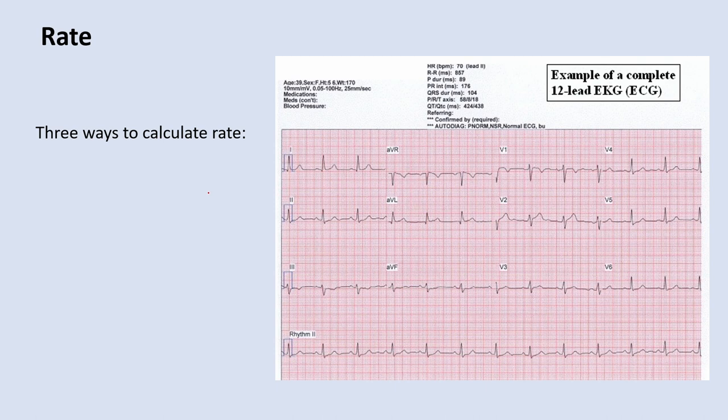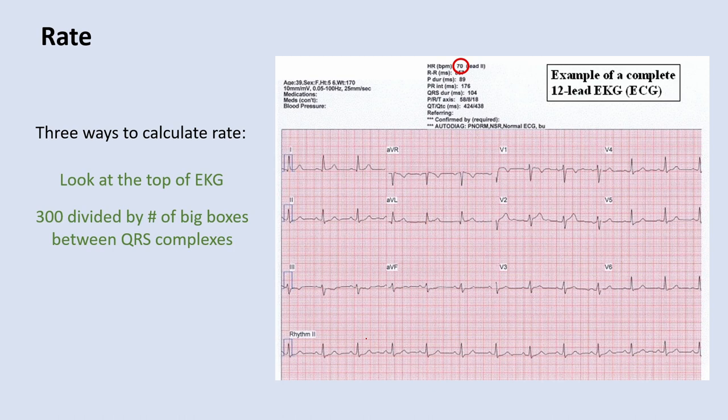The first thing we're going to look at is the rate. There are three ways to calculate the rate. The first is kind of sarcastic — just look at the top of the EKG and you can see that the heart rate is 70. But you also have to know the other two ways. One of the most common is to count the number of big boxes between each QRS complex. If you count about four big boxes, you take 300, divide by four, and get an approximate heart rate of about 75.